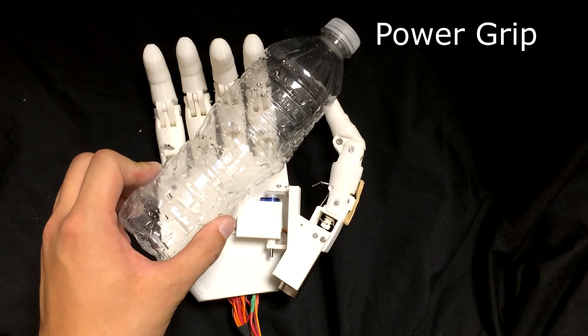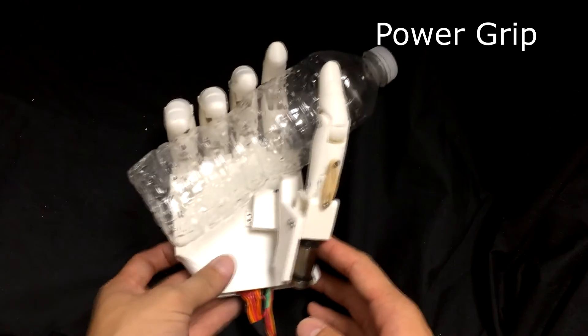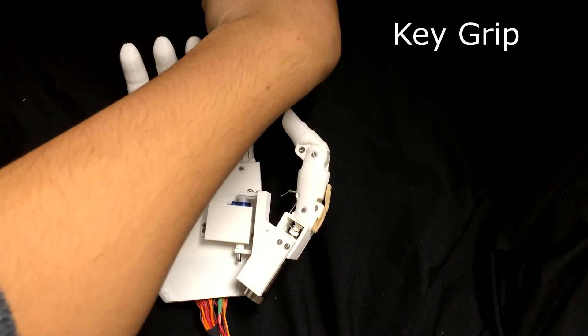In addition, we show the hand making a power grip to grasp a bottle, and a key grip to grab a key.